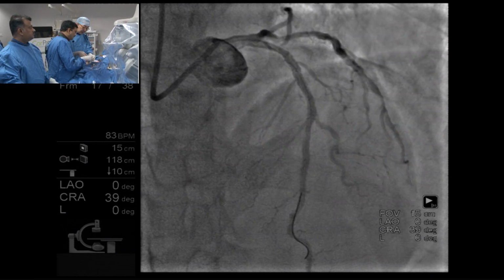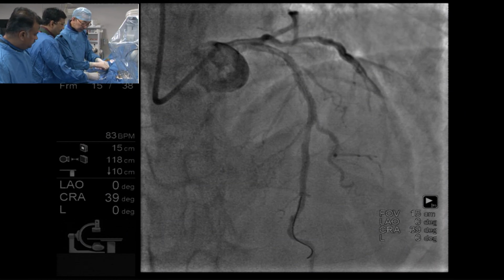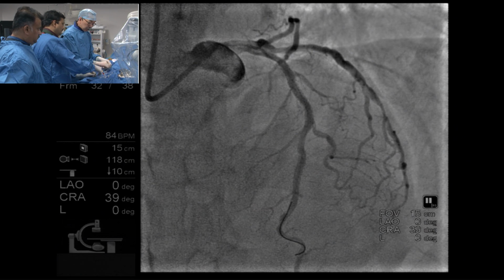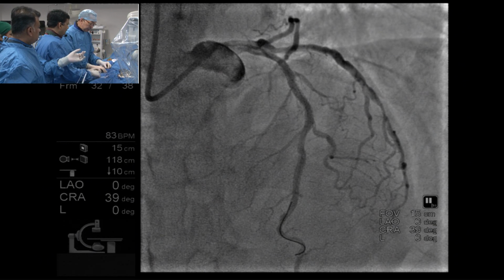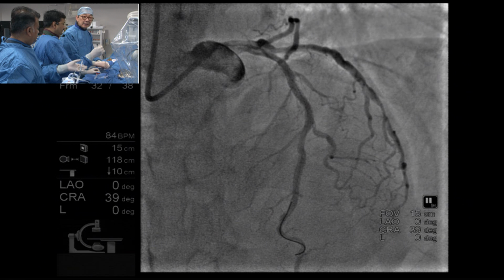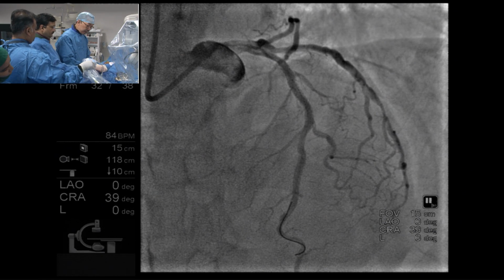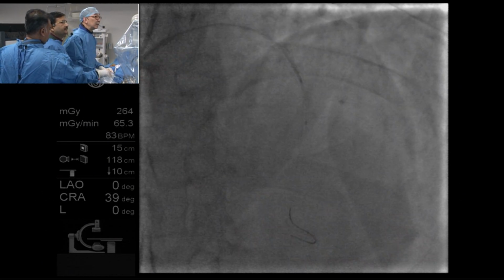What MLA are you aiming for now that you have deployed the stent? According to the Illumin study, the stent area should be at least 5, and 90% of the reference diameter. We don't see much distal dissection, and we covered the distal plaque. We don't want to see 50% plaque at the distal and proximal segments. This is the definition of a good result with IVUS guidance, so a 5 MLA in the stent will be the optimal one.